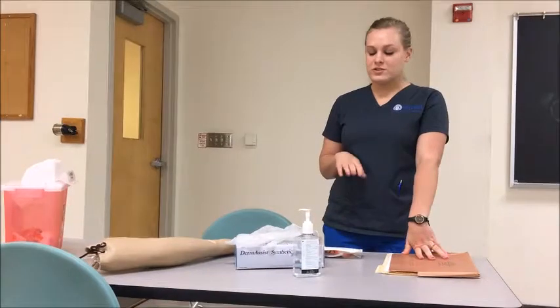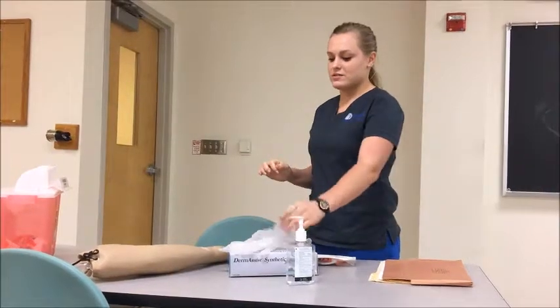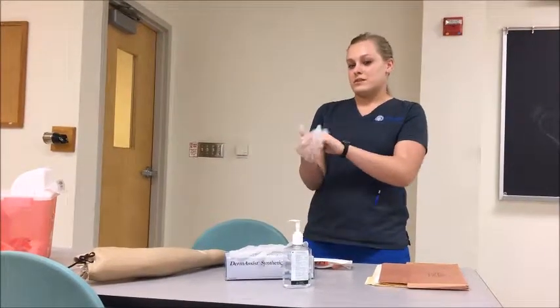Today I'm going to be doing an ABG, and I'm making sure the doctor put in an order in the patient's chart, and the patient doesn't have any allergies or anything that can contraindicate taking an ABG. While I'm doing this, I'm sanitizing my hands for 15 seconds and putting on gloves. The reason for this procedure is to assess the patient's oxygenation and ventilatory status and to determine their acid-base balance.